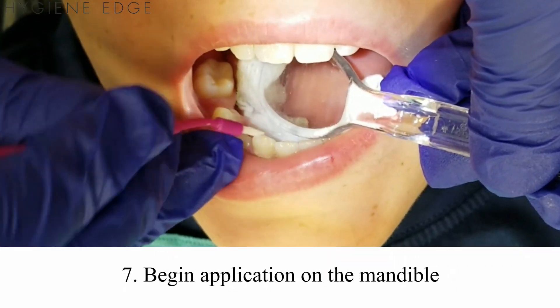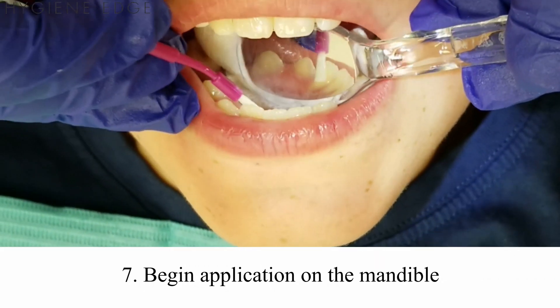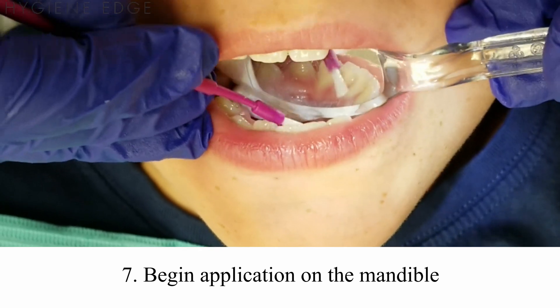If you start on the maxilla, saliva will start to pool on the mandibular arch. Then when you try to apply it, the saliva will be harder to manage and the varnish can set early, preventing proper application.